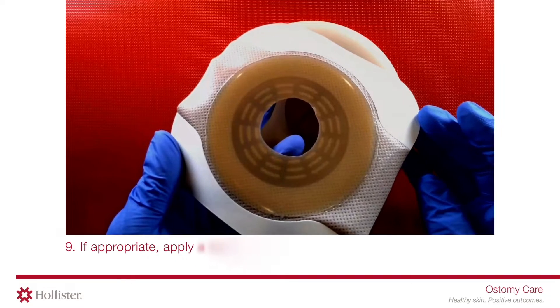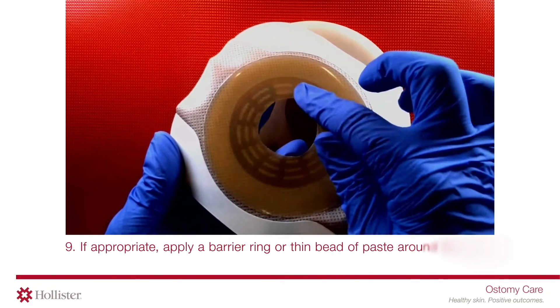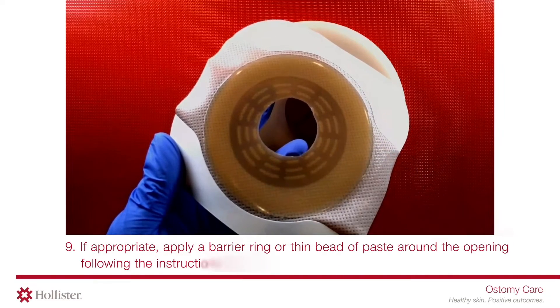If appropriate, apply a barrier ring or thin bead of paste around the opening, following the instructions for use.